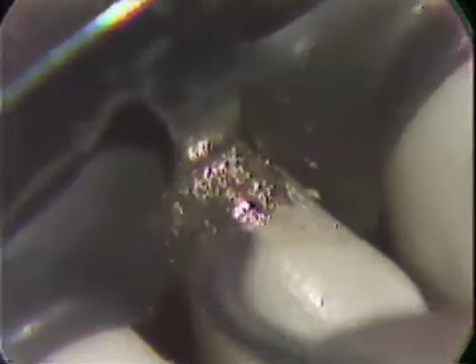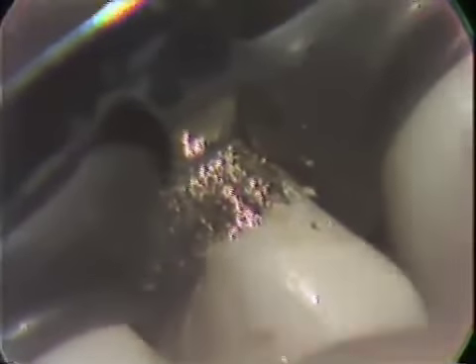This is really a continuation of the condensation, even though it does initiate also the contouring and finishing.